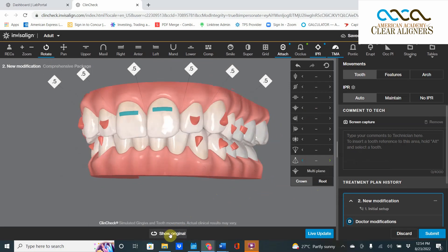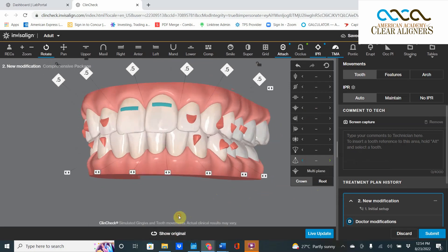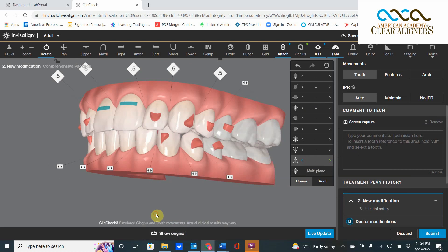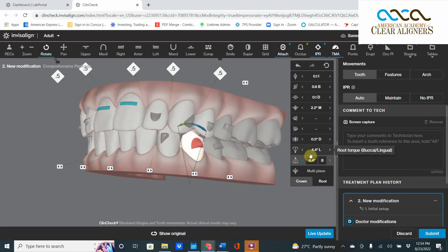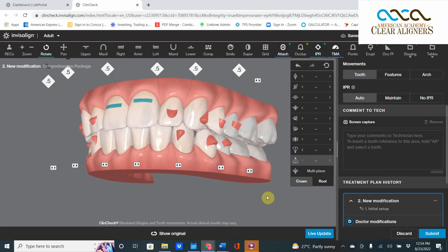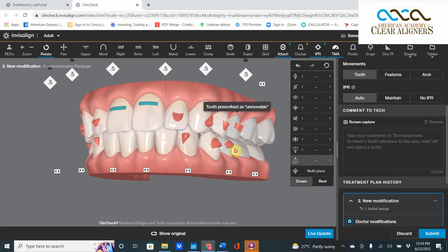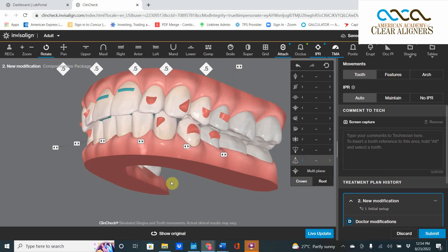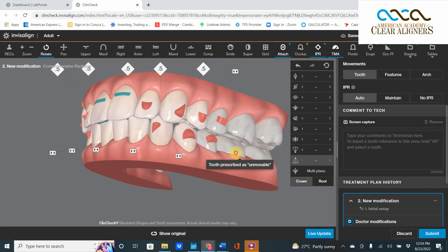Can even do a little bit more. A little bit more tipping, there you go. And now my end-stage occlusion is good. Buccal crown torque is your best friend in the whole game. Make sure you use it. Hey, you know what? This one, let's do this one too. Look at this molar here. Buccal crown torque that sucker.